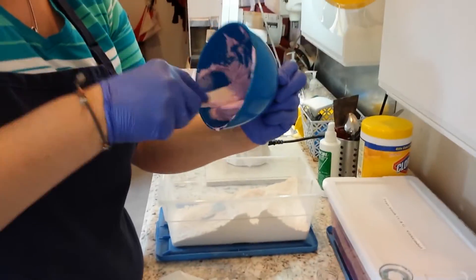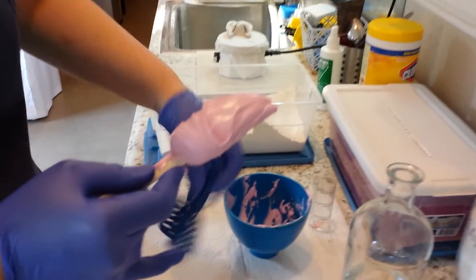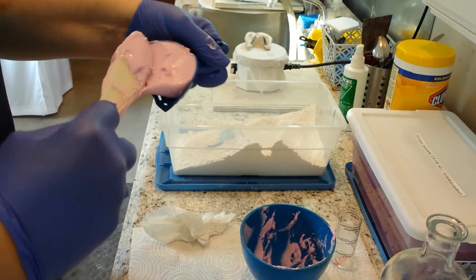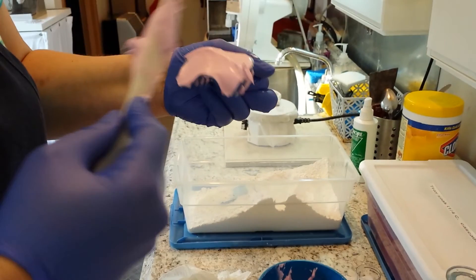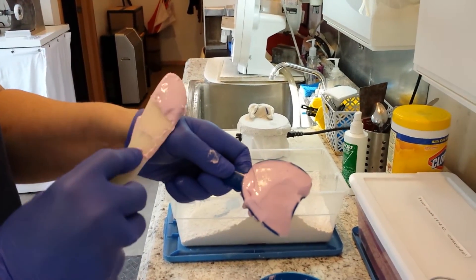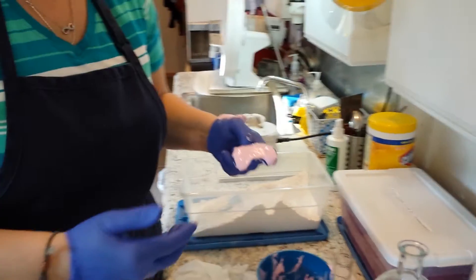If you find that the impression you took is very grainy, retake it — most likely we're not going to be able to use it in the lab. Go ahead and squish the material into your tray and flatten it out. You don't have to use all of it, because too much is going to end up gagging your patient.